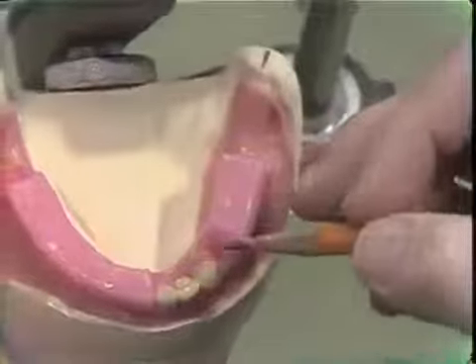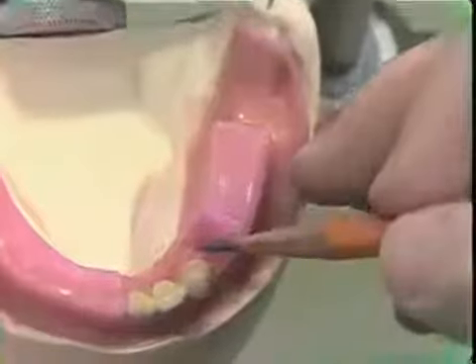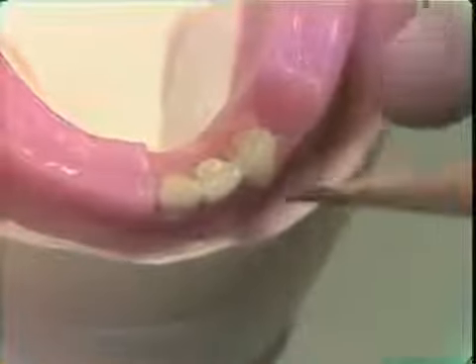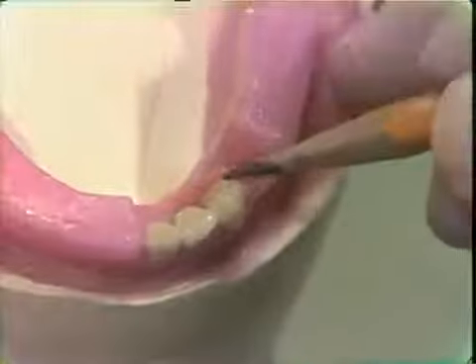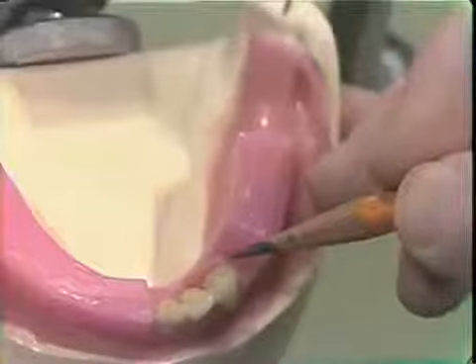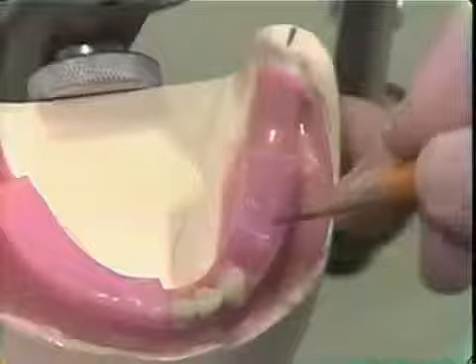From the incisal edge, the mandibular cuspid has a mesial and distal incline. The mesial incline is harmonious with the anterior curve developed by the lateral and central incisors. The distal incline is directed posteriorly.